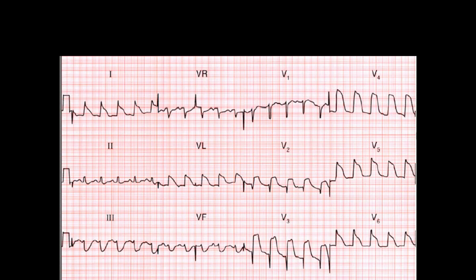So here, let's see this ECG. You can see this is the TP segment. This is the TP segment, and this is the ST segment. And you can see ST segment is elevated in lead 1. Let's go to the other leads. Here, there is a slight ST segment depression as compared to the TP segment. And here again, ST segment depression is present. In AVL, ST segment elevation is present, okay, and here in cardiac leads, ST segment elevation, elevation, elevation. So these all indicate elevation.